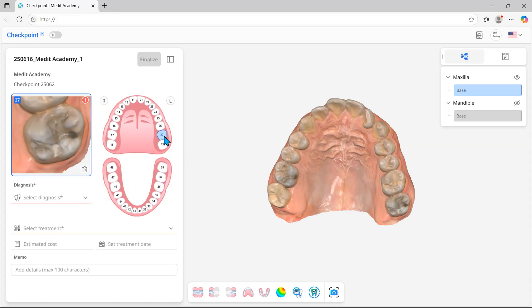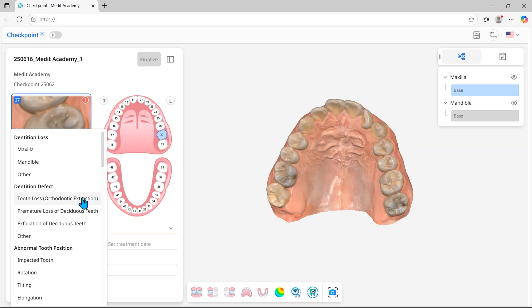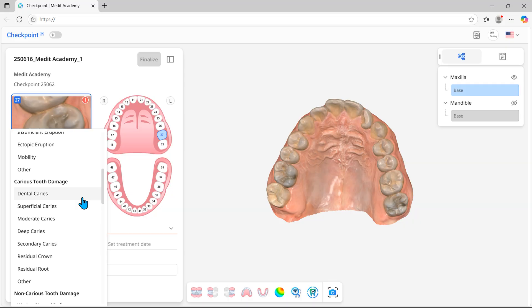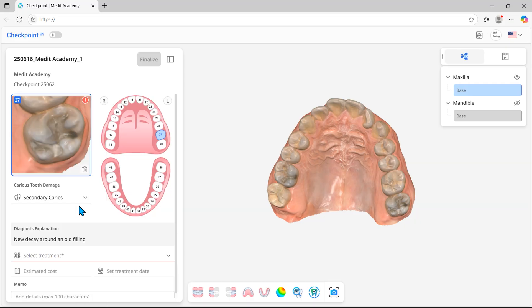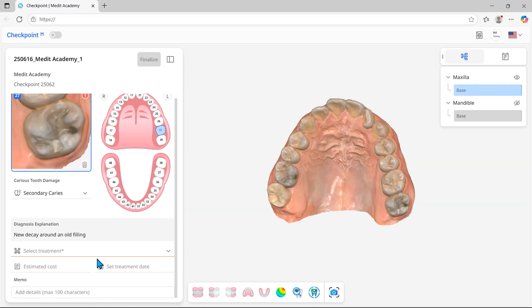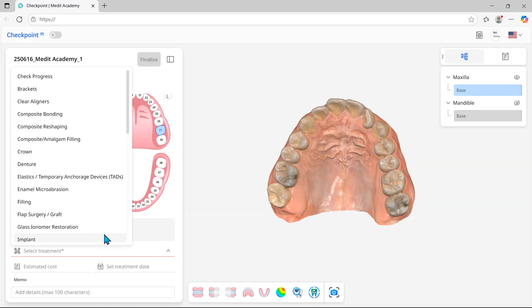Select the tooth number and diagnosis. Then, choose the treatment.